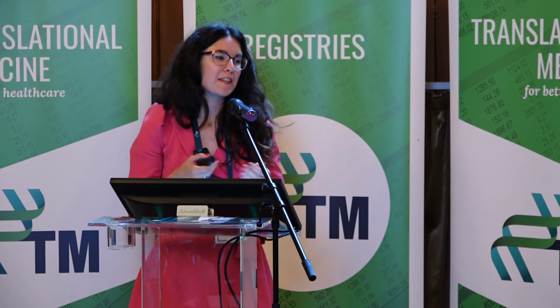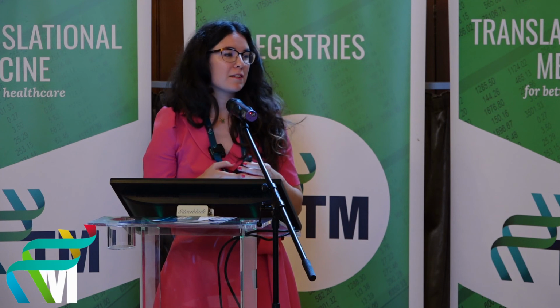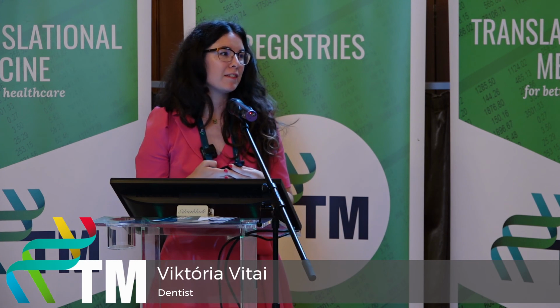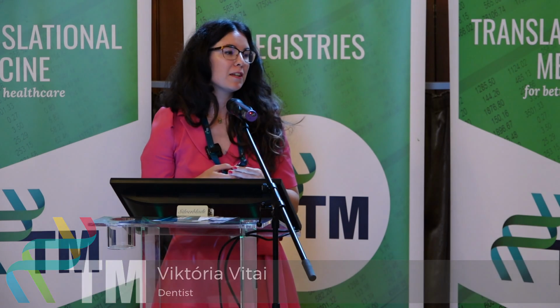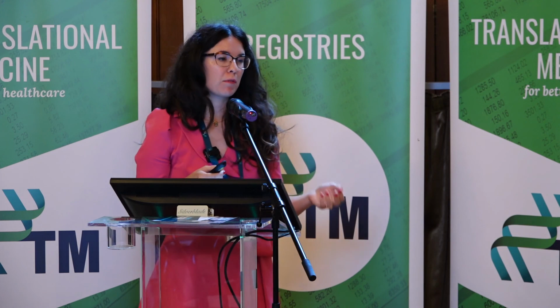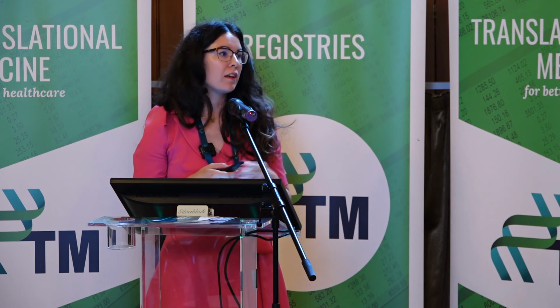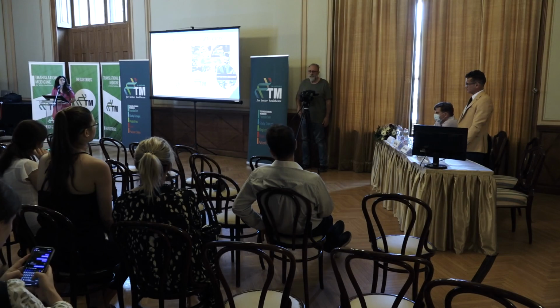Yes, even if the scanners can catch the right color, it is another question if we can reproduce it in the prosthetic part as well. So it is another interesting topic, yes. But mainly the scanners cannot really give the information on hue, chroma, and any other values. They just measure the same in the same codes as Vita Classical and 3D Master, and they cannot give us the information on the three type of values, unfortunately.